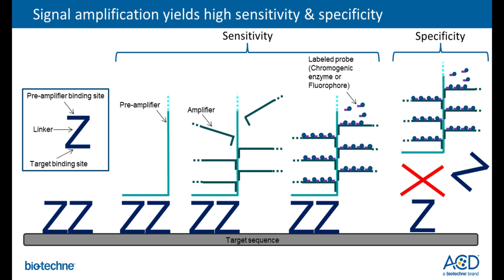In this next slide, I'm going to go into a little bit more detail to talk about our probe design strategy and the signal amplification system, the two key features of this technology that make it stand apart from some of the techniques that are out there.